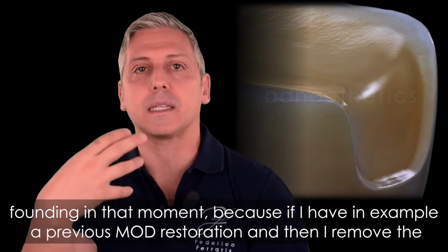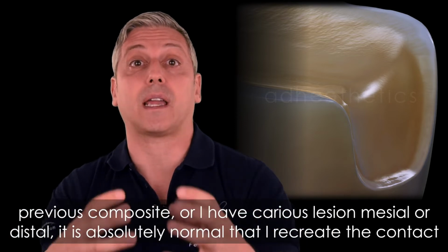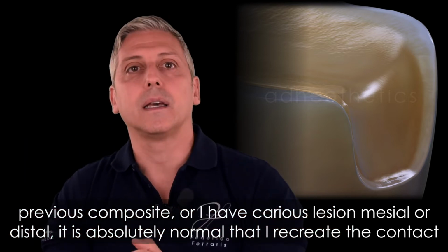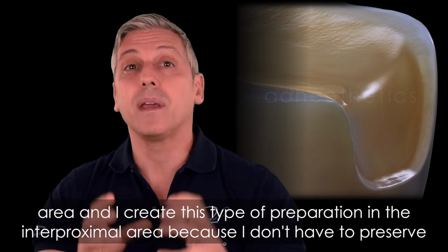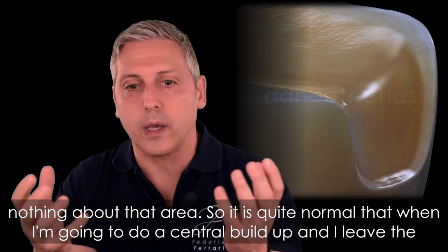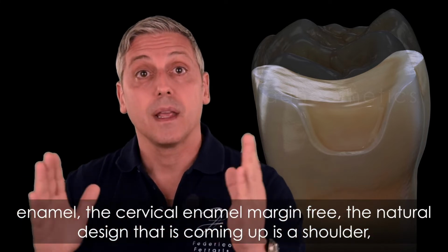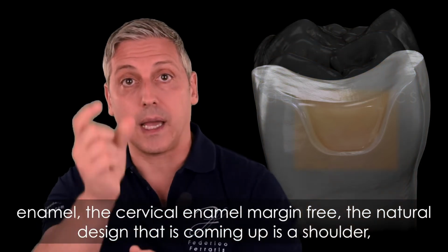Because if I have, for example, a previous MOD restoration, and then I remove the previous composite, or I have a carious lesion, mesial or distal, it is absolutely normal that I recreate the contact area and I create this type of preparation in the interproximal area, because I don't have to preserve anything about that area. And so it's quite normal that when I'm going to do a central build-up and I leave the cervical enamel margin free, the natural design that is coming up is a shoulder, an interproximal slot.